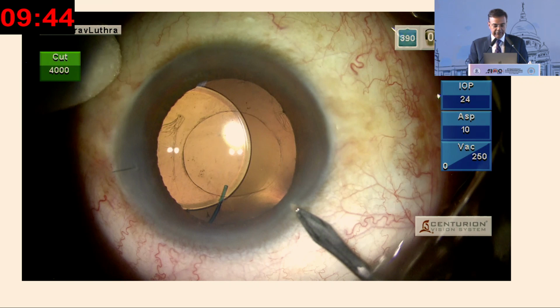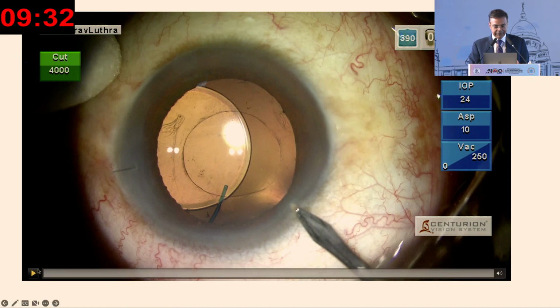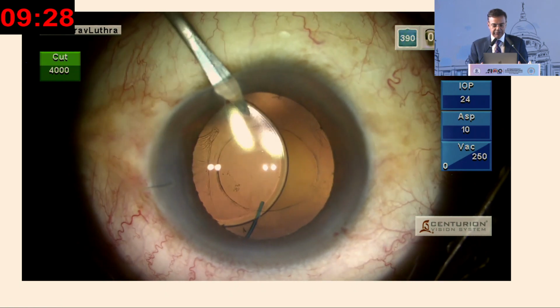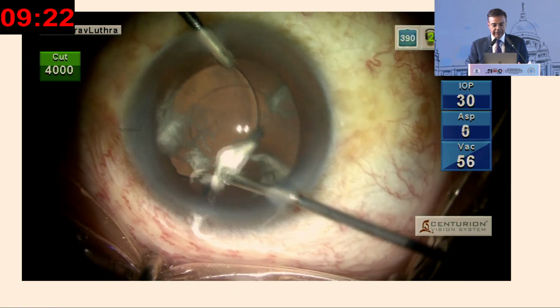So he wanted me to take out a few of these subluxated IOLs. So I thought after all those really complex surgeries from the top surgeons, I'll show you something straightforward and simple. This patient presented to us with a decentered IOL. He had been operated elsewhere and had an IOL which was slightly dislocated to one side.